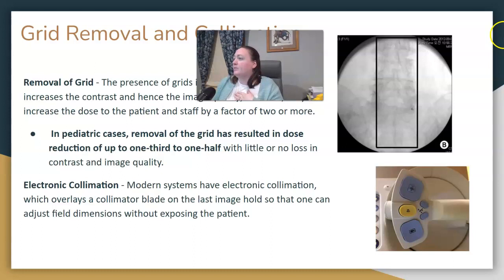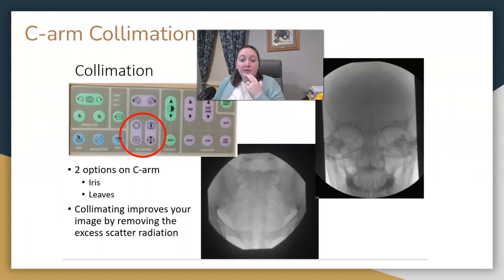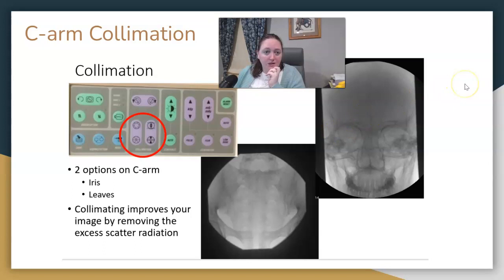Here's an example: they're going to collimate into a specific area, so when they take the next exposure, only that area will be visualized. Collimation and beam restriction reduce dose. There is collimation on your C-arm with two options: the iris, which is a circle, or the leaves, which are straight up-and-down and side-to-side. Again, collimating reduces dose.